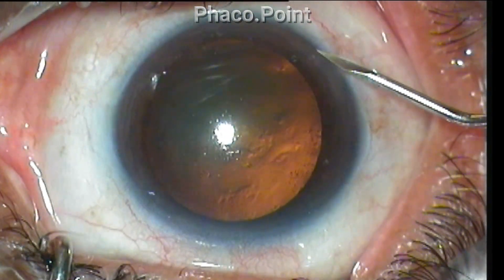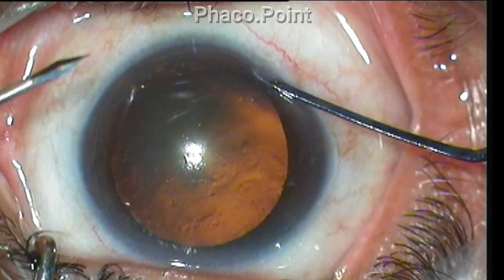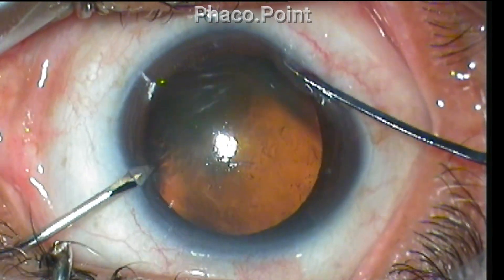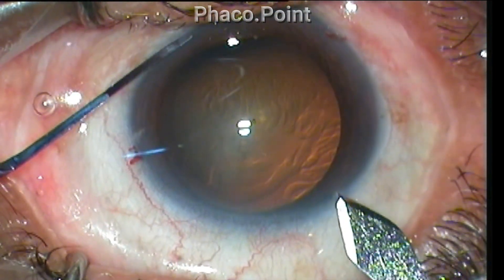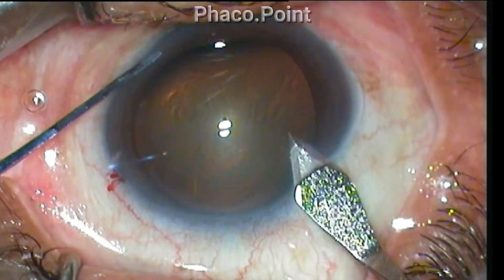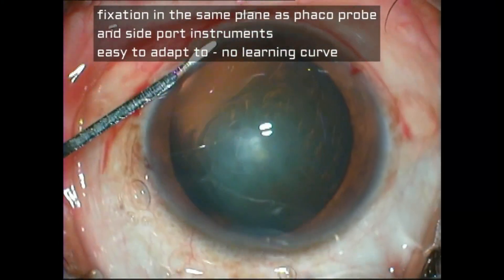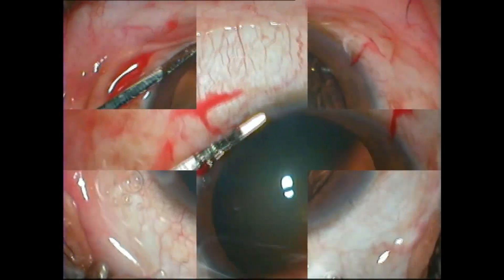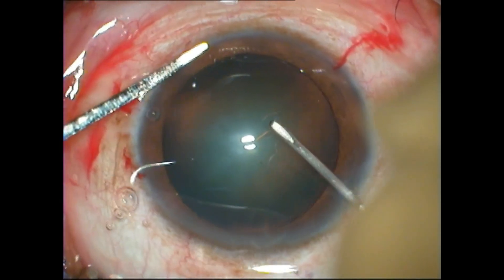This is the corneal pocket incision which I use whenever I perform topical phaco. Two blind pockets are made in the cornea at the 5 and 7 o'clock positions, and using these for counter-traction I create my side port and main clear corneal incision. The advantage is that it helps control the eye even if the patient squeezes, providing a tangential hold along the same plane as the other instruments. There is also no leak or ooze of viscoelastic during capsulorhexis, and the chamber stays well pressurized.